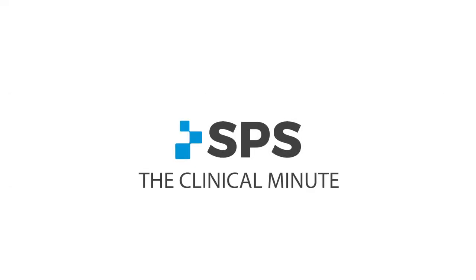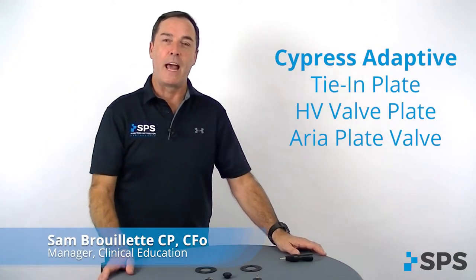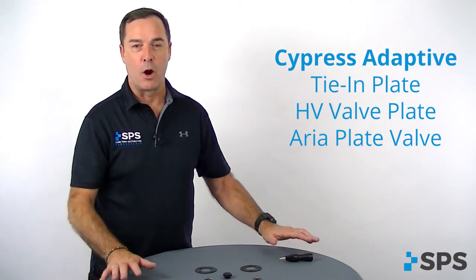Hi, I'm Sam with SPS. Welcome to the Clinical Minute. In this segment we're talking about Cypress adaptive tie-in plate, HV valve plate, and Aria plate valve.